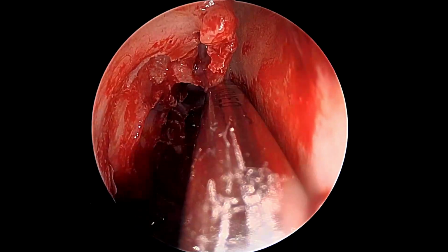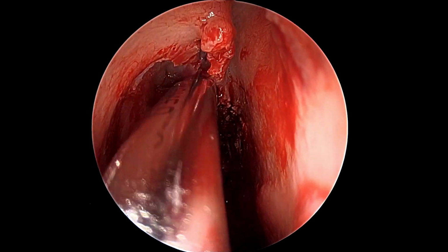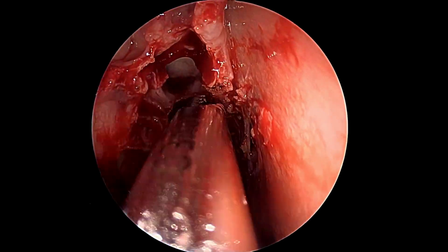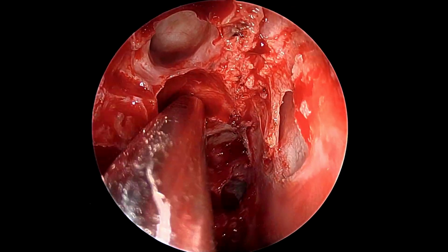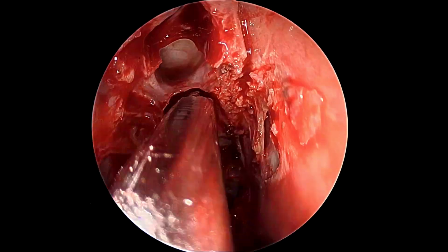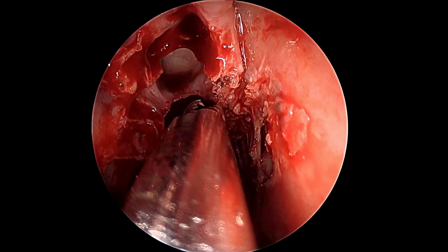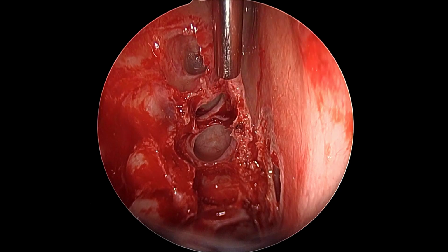No graft, whether it is fascia or free mucosal graft, ever gets attachment onto mucosa. It has to be kept in contact with bare bone, bare cartilage, and it is very important to achieve as much flat bone as possible. It may not be possible to do it completely on all patients, and one must not be overzealous, lest we create any complications or more defects, but one should make attempts.